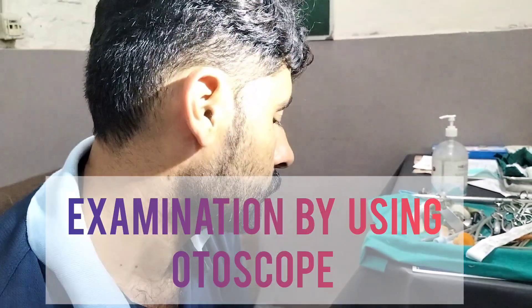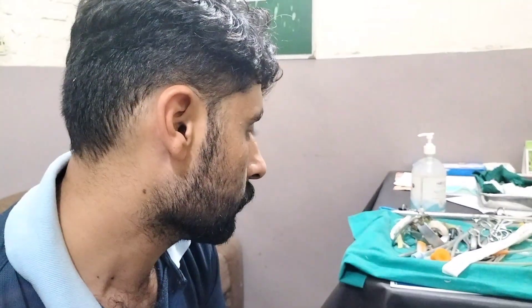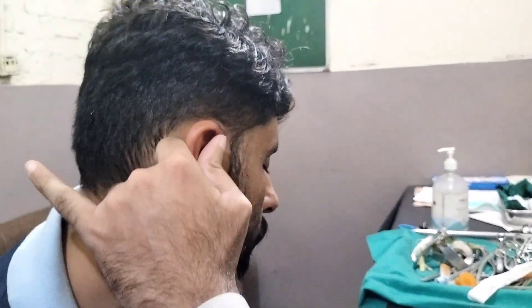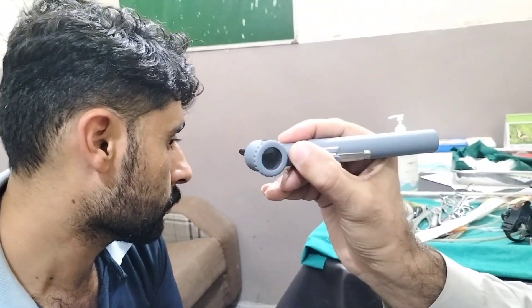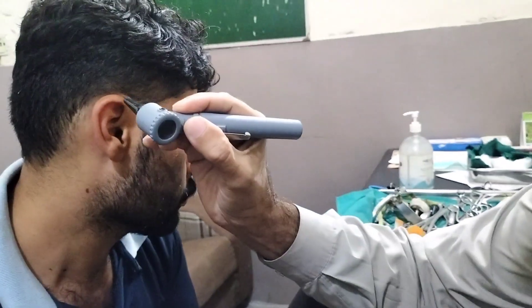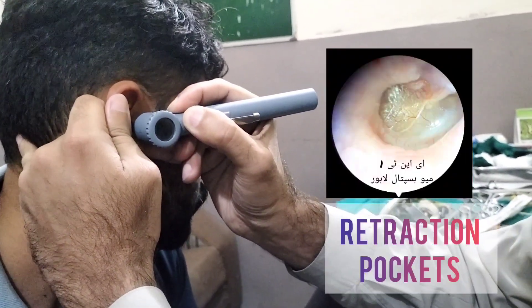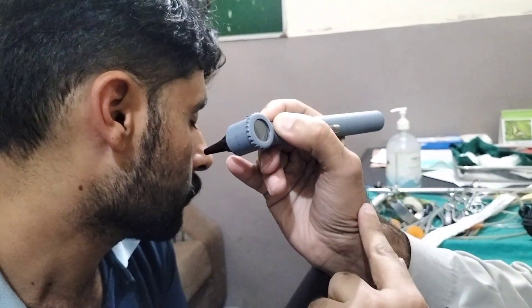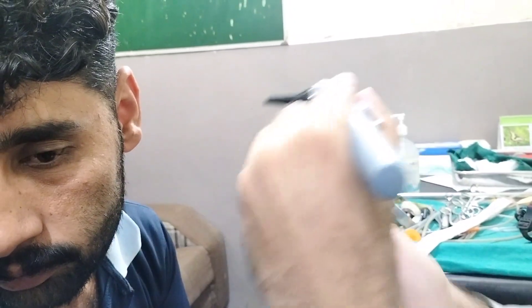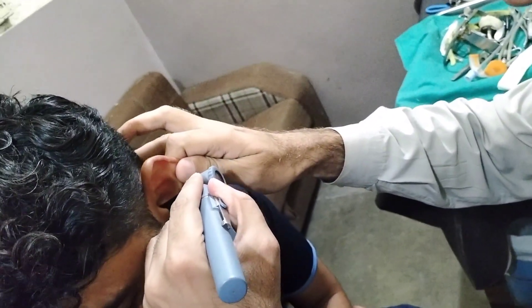Next, examine with the otoscope. Switch off your headlight and switch on the otoscope. Hold the otoscope like a pen, rest your hand on the patient's zygoma, pull the pinna, and gently insert the otoscope to look through the magnifying glass. For the right ear hold it in the right hand; for the left ear hold it in the left hand. Always rest on the patient's zygoma for stability.